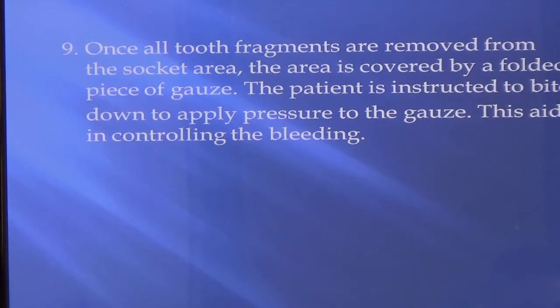And normally we'll hold them here at least for the first gauze change, which is about 5 to 10 minutes after the extraction. We'll change it just to make sure it's not oozing blood still. It'll still be bleeding a little bit, but you want to make sure that it's going to stop. Sometimes you take out that first gauze and then blood's just continuing to come out.